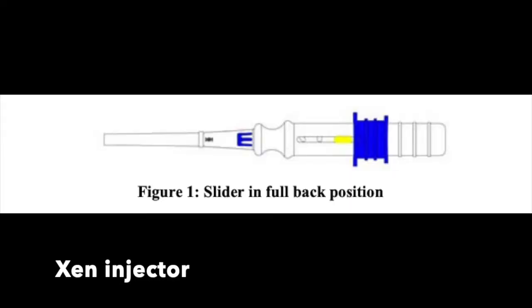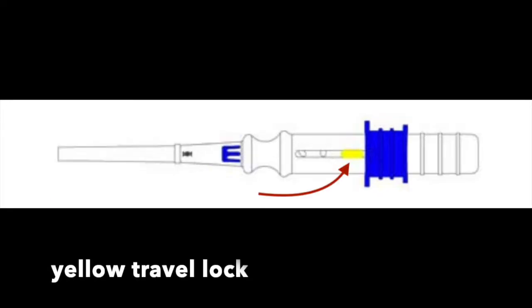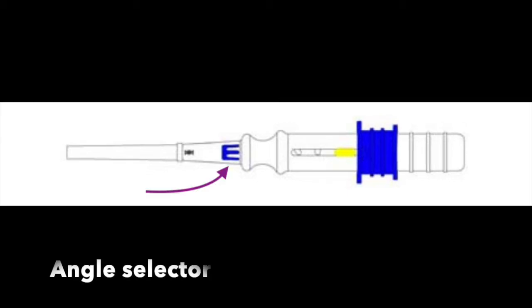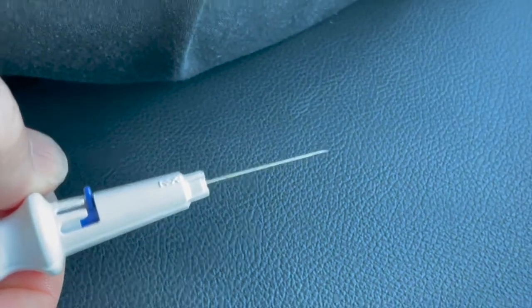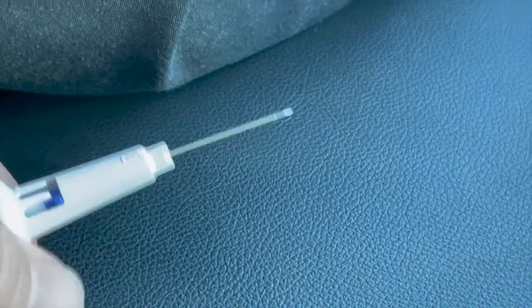The entire device that comes out of the packaging is referred to as the XEN injector. The clear cap at the tip of the needle is referred to as the needle cap. The yellow travel lock prevents the slider from moving forward during shipping. There is a very rarely used angle selector that, when moving it side to side, will dextro and levo rotate the needle along its long axis.